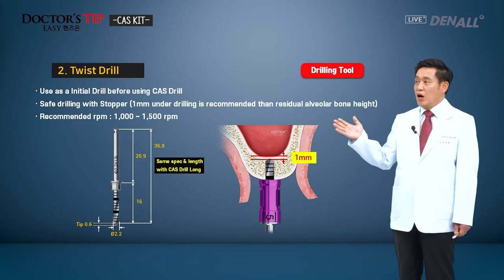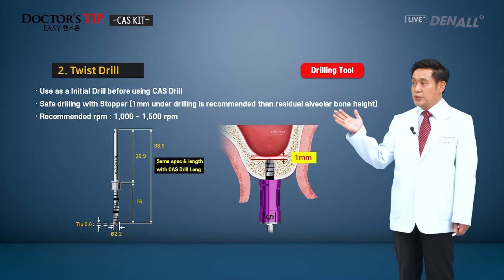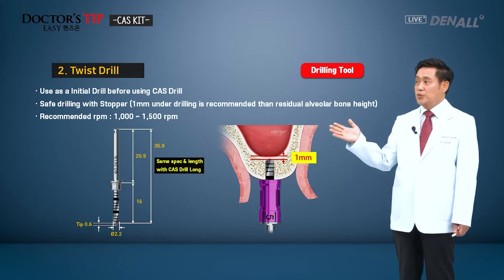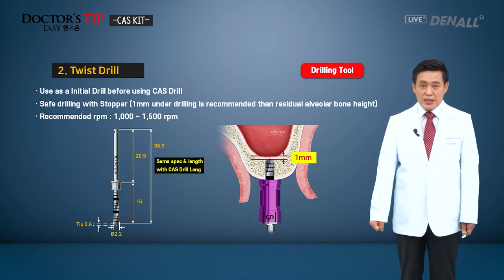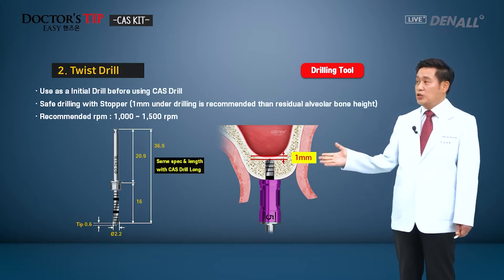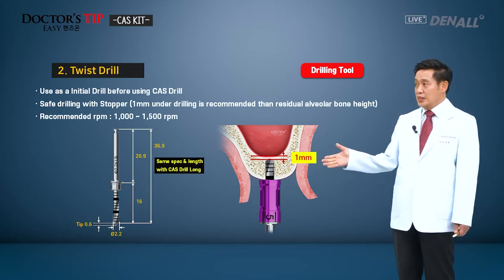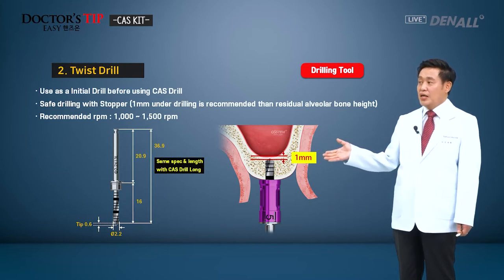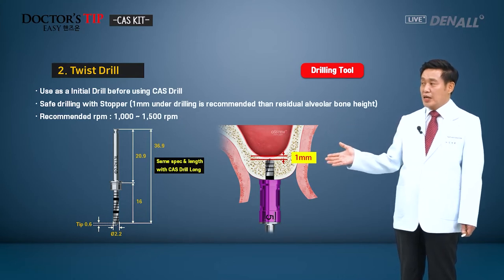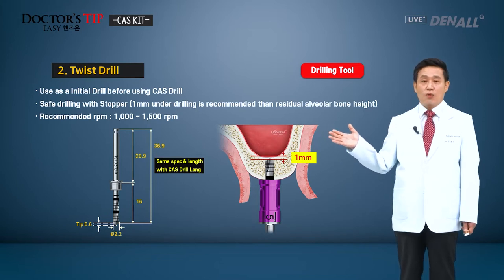Next, the twist drill. After the initial drilling, this can be used before using the CAS drill. In the case of the twist drill, on the panorama or CT, after evaluating the residual alveolar bone height at the maxillary posterior region, you need to under drill by 1 millimeter less than the height to be safe. Its specification is the same as the CAS drill, and the stopper can be used to adjust the length of the drill.